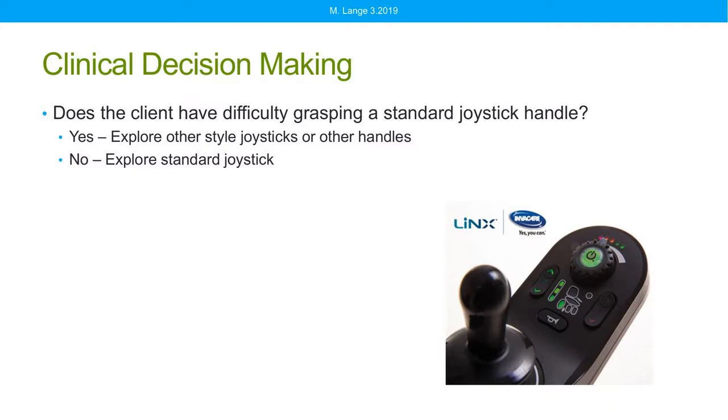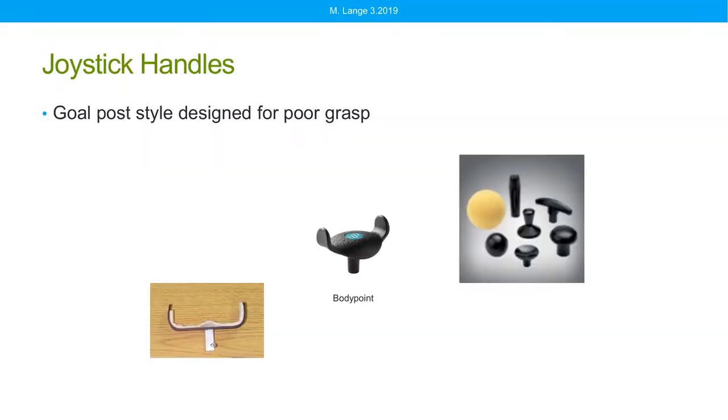If the client has difficulty grasping a standard joystick handle, there are a variety of handles on the market. Now, for all the handles that are out there, I gotta let you know that I don't use these very often. The one that I mostly use is the goalpost style handle that you see here.